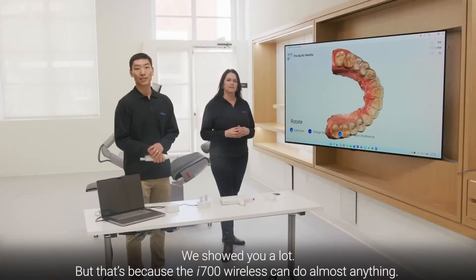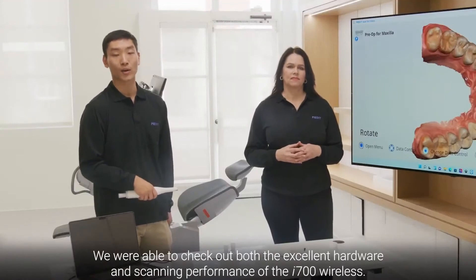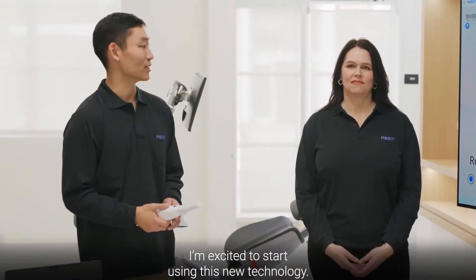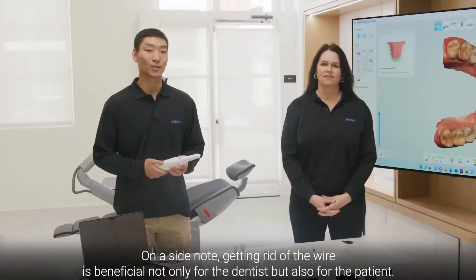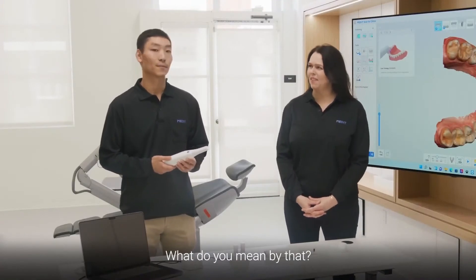We showed you a lot, but that's because the i700 Wireless can do almost anything. We were able to check out both the excellent hardware and scanning performance of the i700 Wireless. I'm excited to start using this new technology. I was also surprised by the scanning performance. Getting rid of the wire is beneficial not only for the dentist but also for the patient.